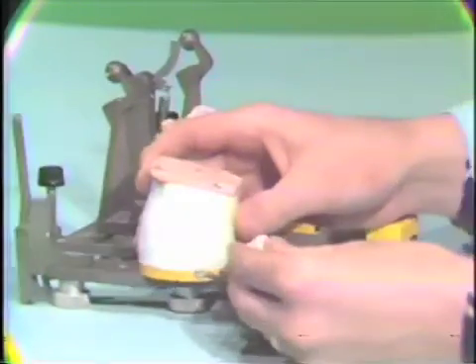You can see here it doesn't stick to our fingers. It's in kind of a doughy condition. And we'll insert this into our condylar blank area and kind of pat it down such that we'll do this on both sides.